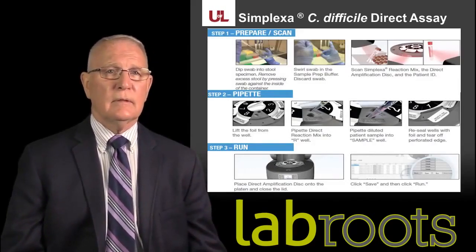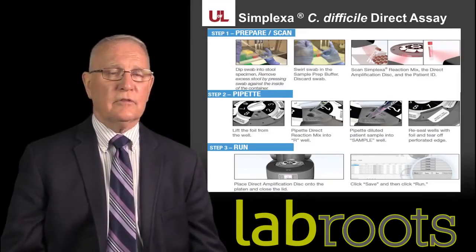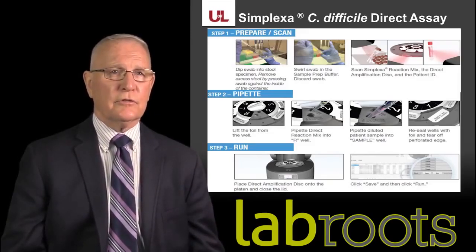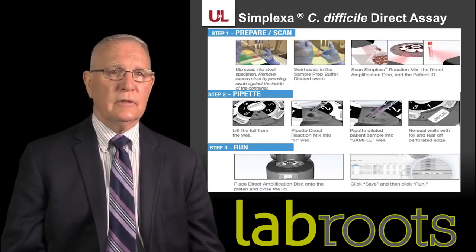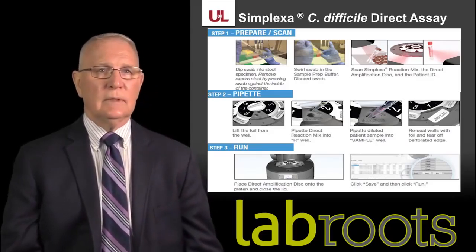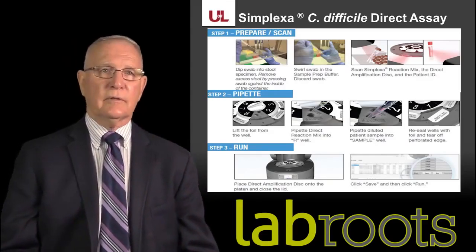So you simply take the stool sample, you dip a swab into that sample, and remove any excess stool by pressing the swab against the inside of the container.